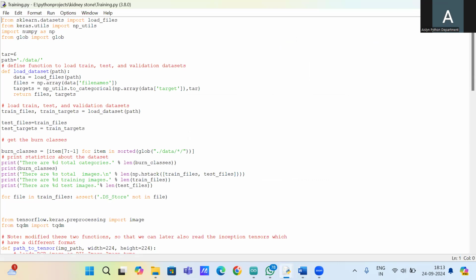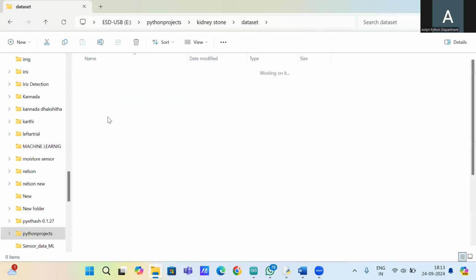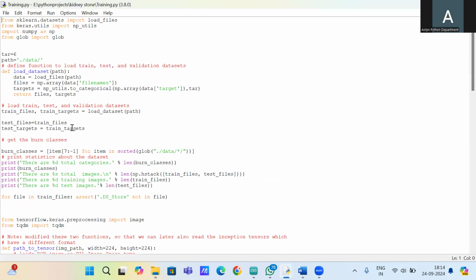Before that, I will show you our dataset. Yeah, this is our dataset. Total six classes. Yeah, this is our training code. Target is six because we have six classes. Path is nothing but our dataset path.